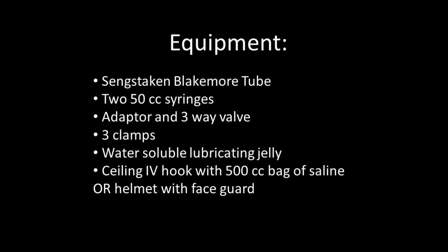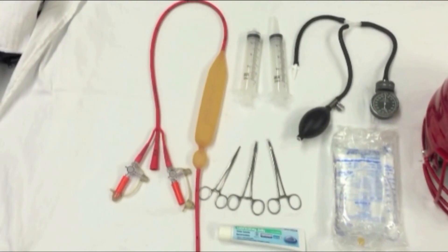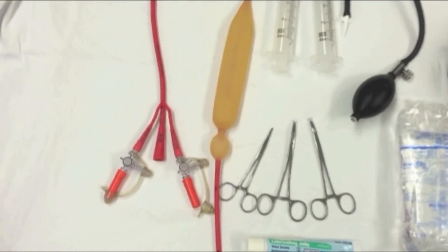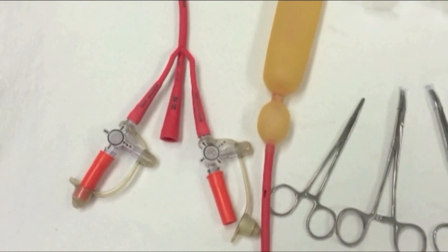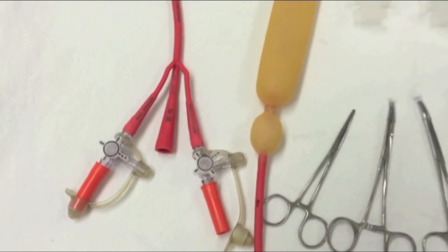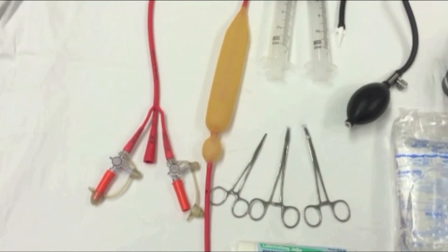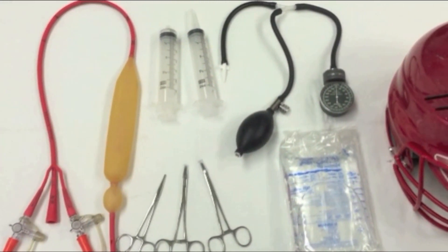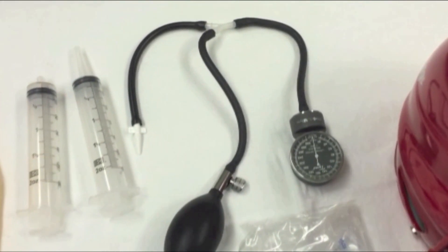The following items will be needed for this procedure. The Blakemore tube consists of three lumens: one for the gastric balloon, a second for the esophageal balloon, and the last lumen for gastric content aspiration. Two 50cc syringes are needed — one to inflate the gastric balloon, and the second to suction out the gastric and esophageal contents. An adapter, or Y-tube connector, is needed for the esophageal balloon.